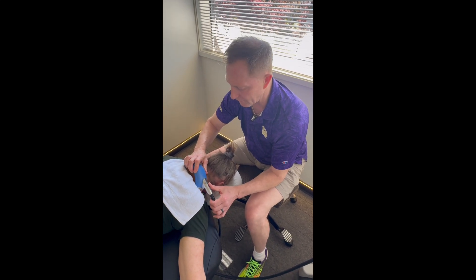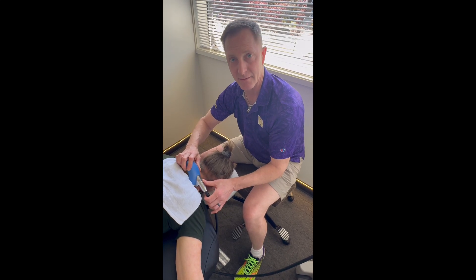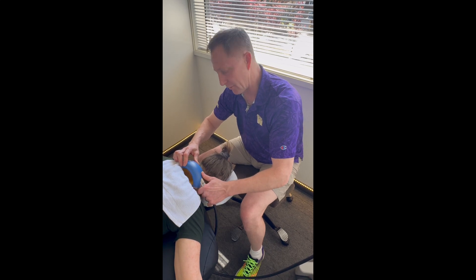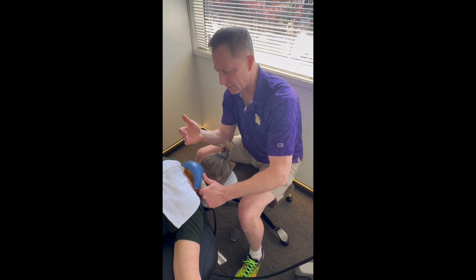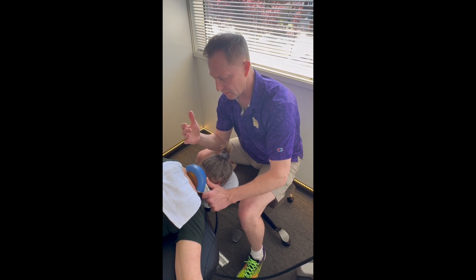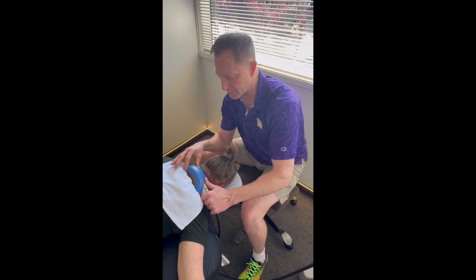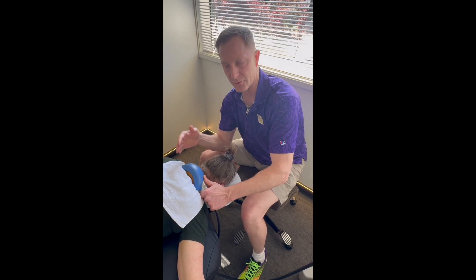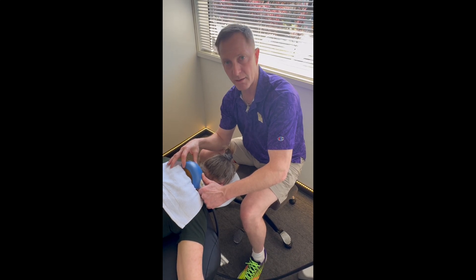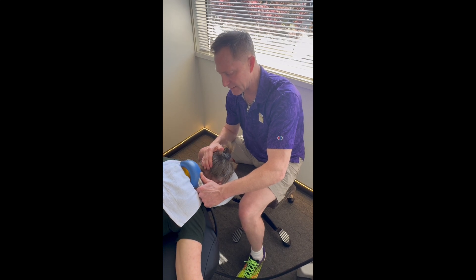For those patients always telling their therapist 'go deeper, go deeper, go deeper' — this is exactly what we'd suggest: using the piezo wave. Here at the clinic, Darshida knows how to use the piezo wave — in fact, it was her idea to bring it in. We also have Matt, our yoga and exercise specialist, who is also trained on how to use this.